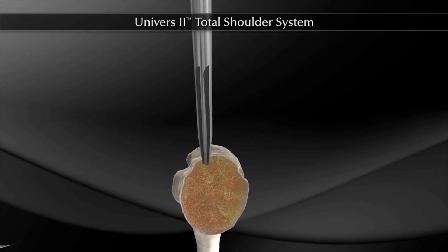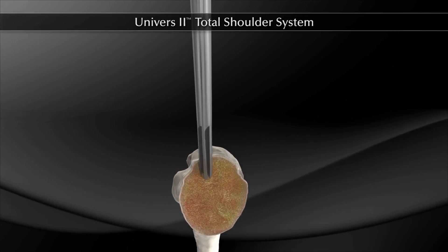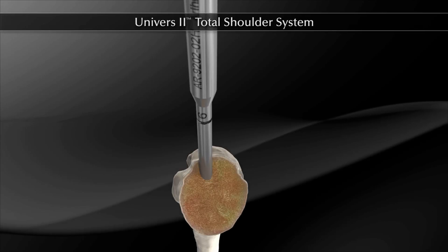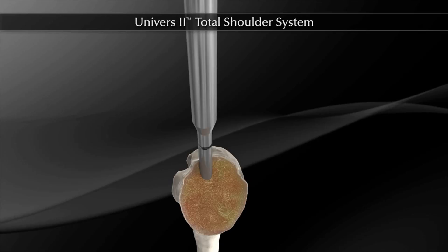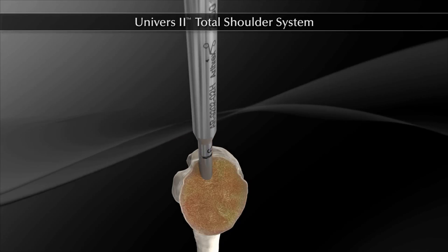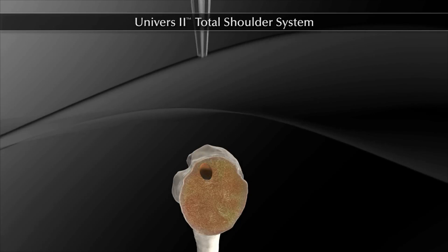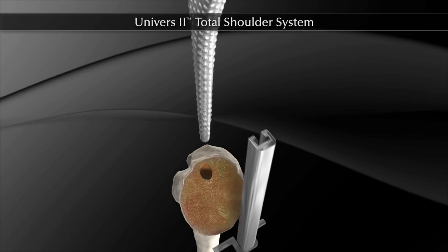The 6 mm reamer is positioned at the superior lateral aspect of the humerus. The reamer is advanced down the medullary canal to the circumferential groove adjacent to the cutting flutes. This step is repeated with a 7 mm reamer if necessary. Then, a starting broach is used to form the humeral canal.